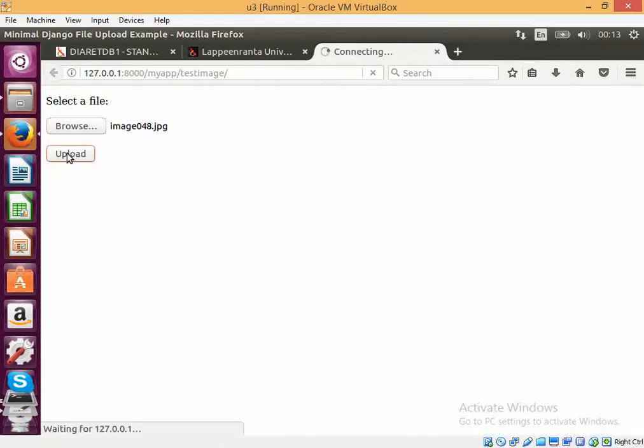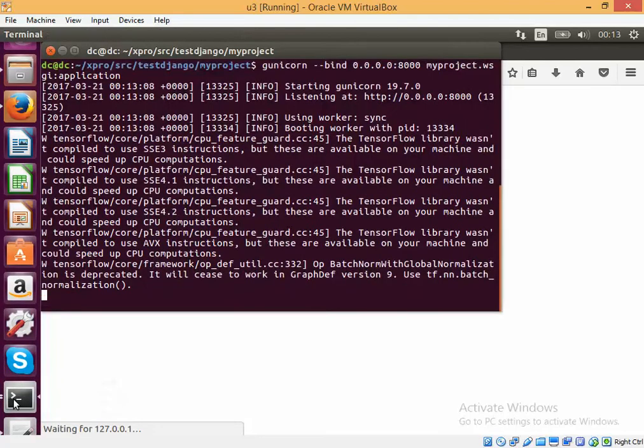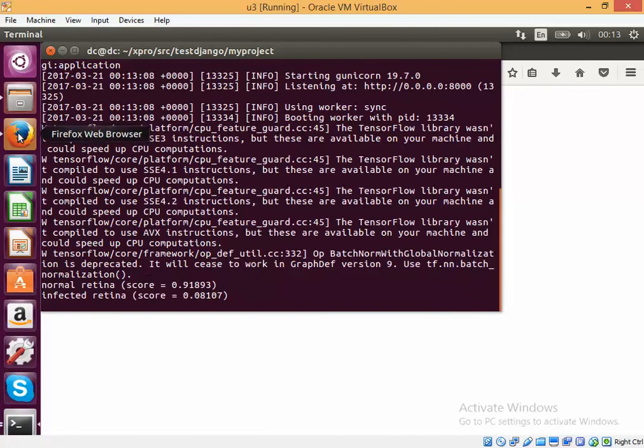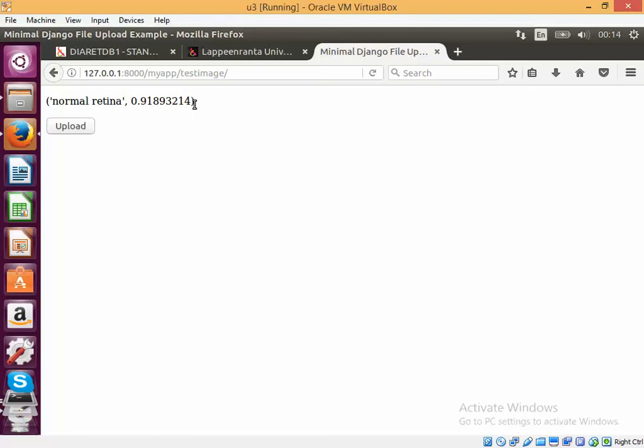Okay, you can see that it's uploaded and it's now running the TensorFlow project. And the program is running and yes, it has already classified it. And you can see that the result has come back on the screen showing a 0.91 probability which is around 92% probability that it's a normal retina.